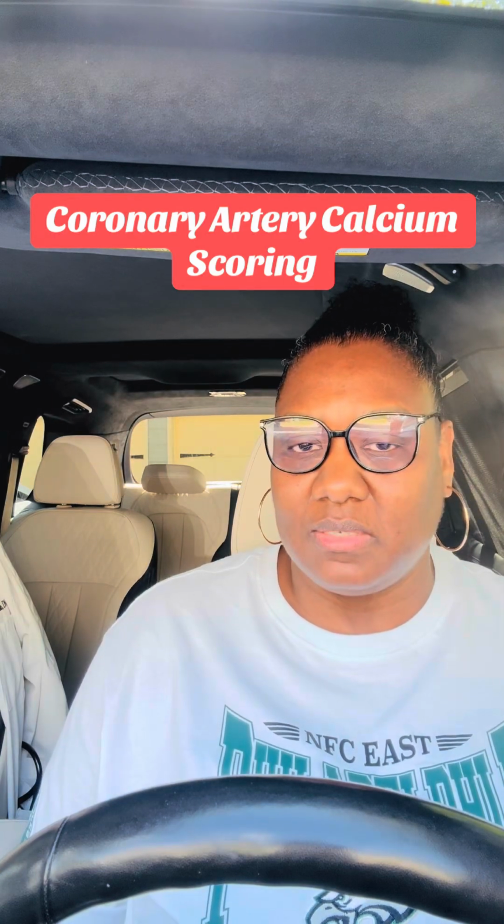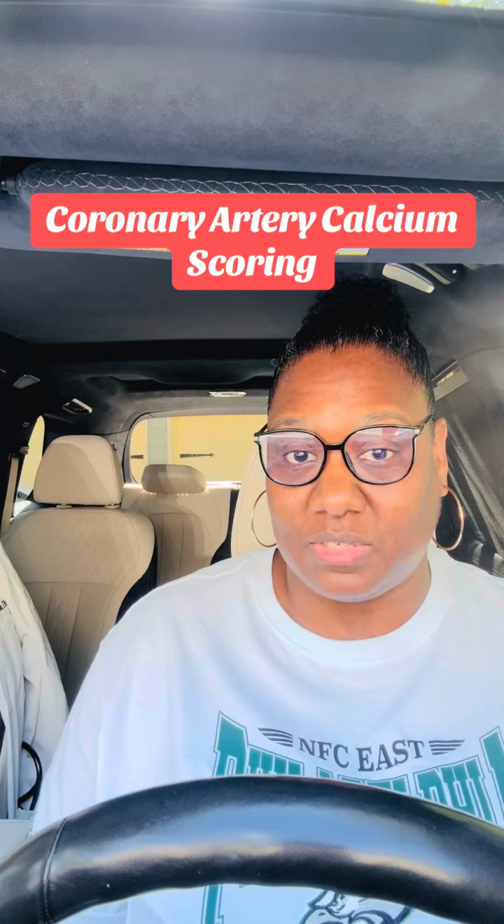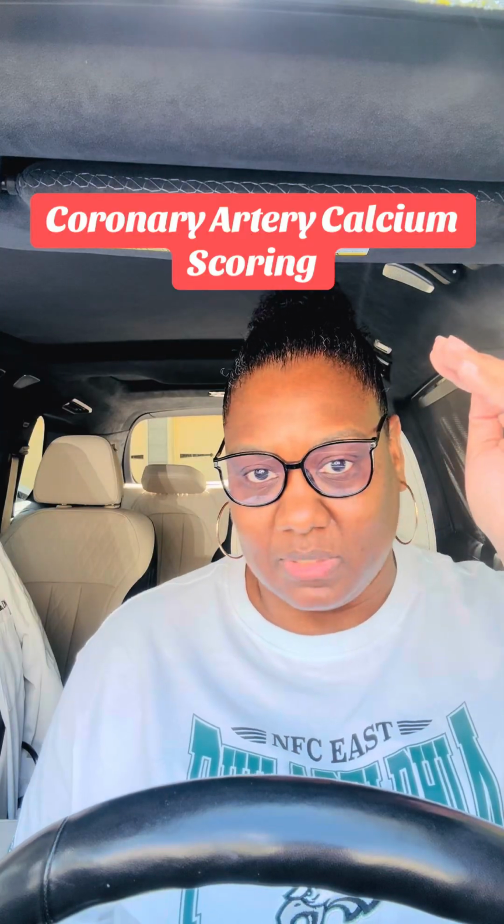Lovely. There is not, as of yet, any discrete information or research that shows what the highest possible calcium score can be, because there are a lot of factors that go into the calculation of that score, lots of variables. So there is no maximum amount of a calcium score that you can get.